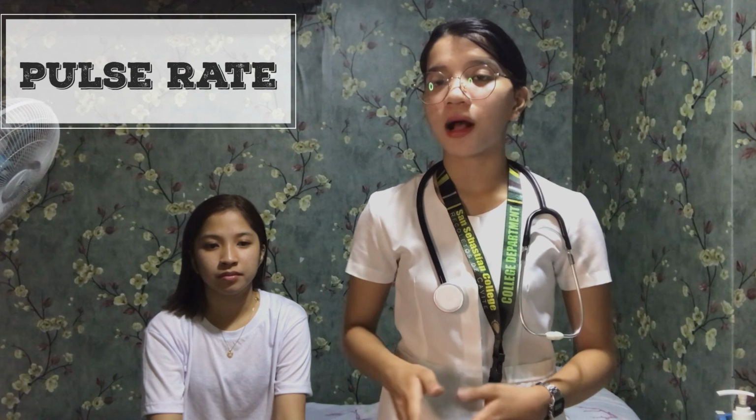After that, insert the thermometer into the ear opening and press the activation button for 1 second. Then wait for the beep. After you hear the beep, record the body temperature and remove the probe cover of the lens because it's disposable, and perform hand hygiene again. And now I'm going to proceed to taking my patient's pulse rate.